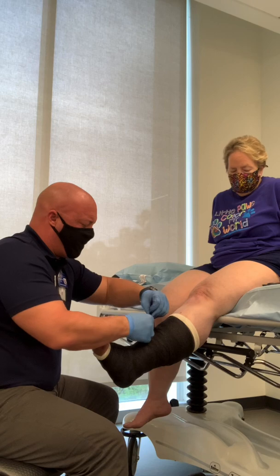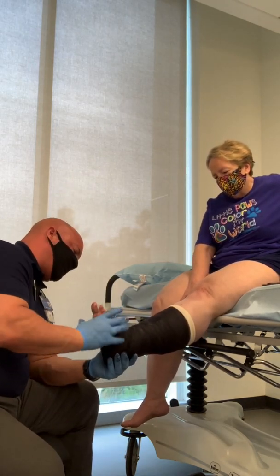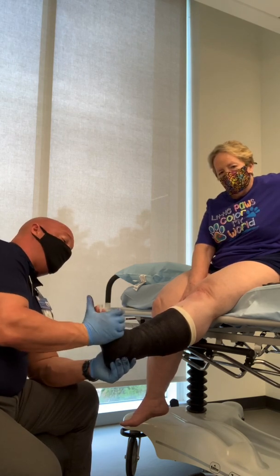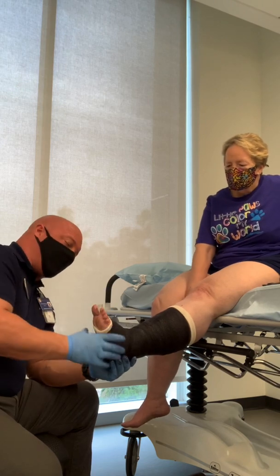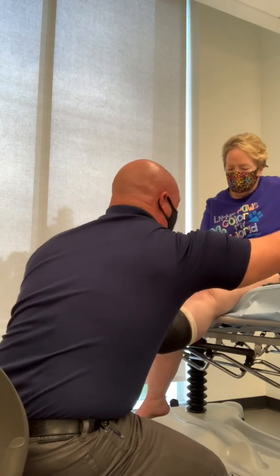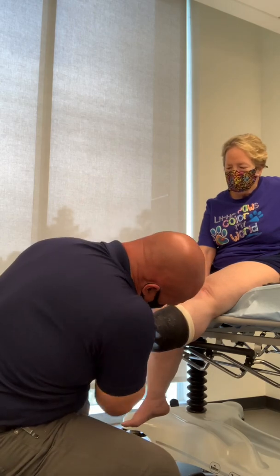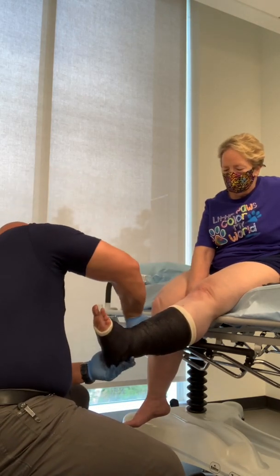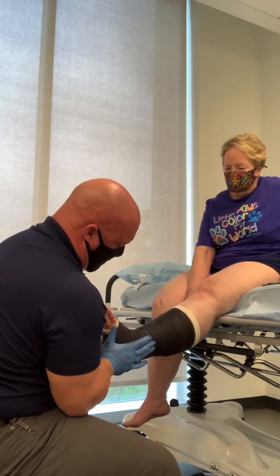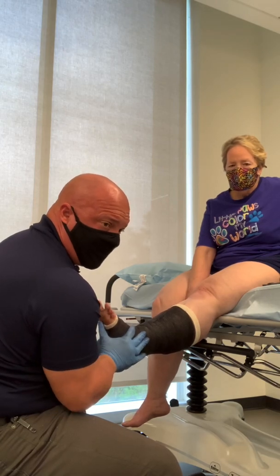With the material still damp, we're going to ensure molding at the proper position — plantar neutral, just about 90 degrees, maybe a little bit more plantar flexion. Then we're going to smooth this material with either the palm or a little bit of excess water until it sets. I'm always ensuring proper position, holding and making sure that I'm maintaining that correct positioning.